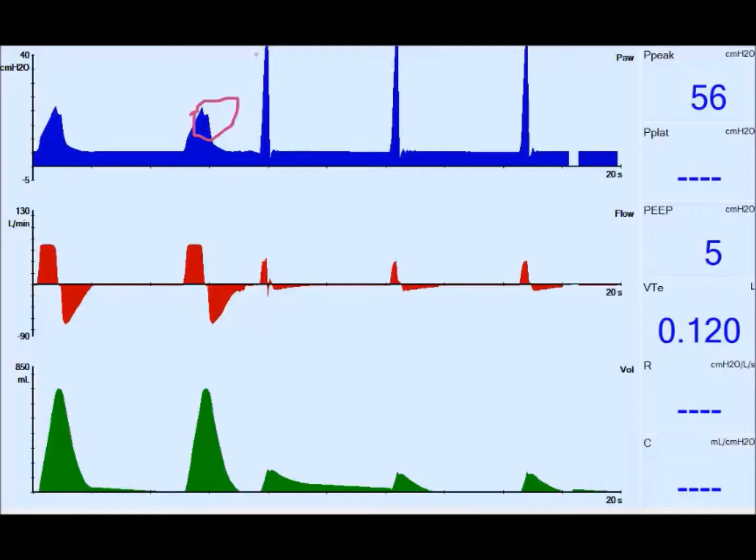The patient's meeting my high pressure alarm threshold, and the breaths are starting to prematurely cycle. I have a phase where the patient prematurely cycles these 3 breaths here. And if we look at my corresponding volume waveforms, at the bottom of the screen in green, that volume is significantly different. That might be very uncomfortable for the patient. As you notice, we have these extremely low tidal volumes now.